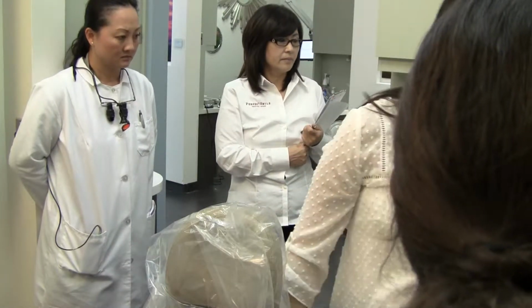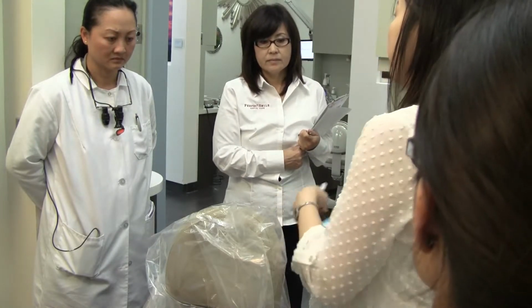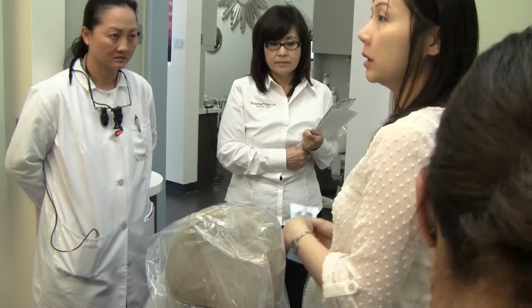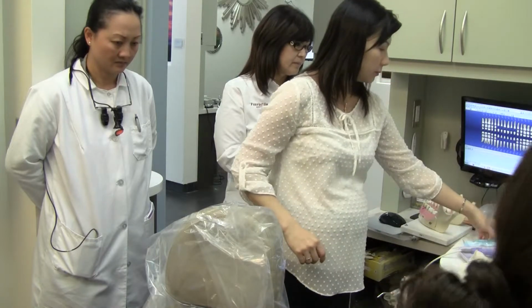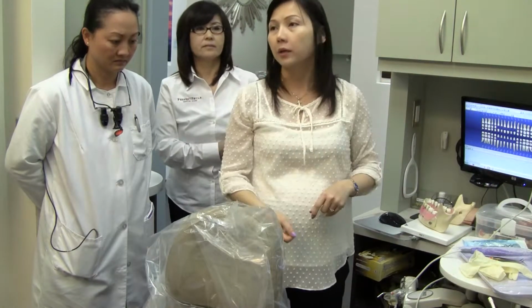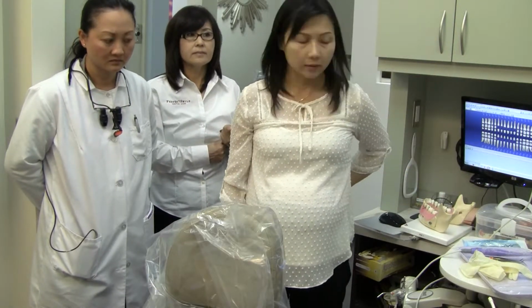There you go. Okay, we should have that. So we grab this right away. You don't need to wait for the whole cassette to come out. You would just hook it up quickly and inject, right? Yeah, any procedure. Anything that you need to numb them, just grab that, do right away, because they're gonna take some time to open up the cassette and everything. Yeah, a lot faster.